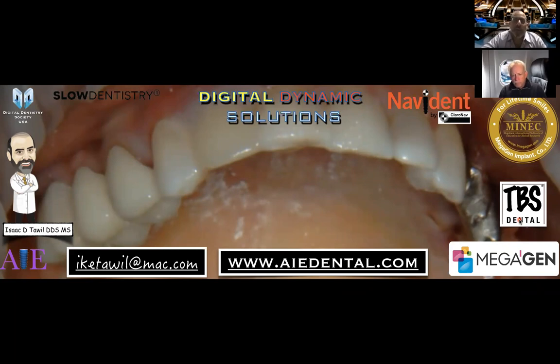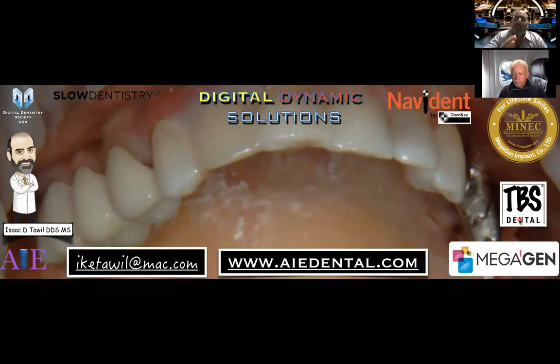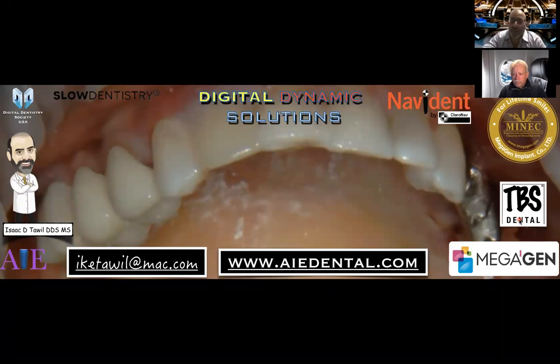Typically in the past, when I was trying to find these curved roots, I would make a guide, a 2mm pilot guide that would take me to that apex. But now with dynamic navigation, I can plan basically a miniature implant into that section where the curved root was, and know that I've actually hit that apex to the 1/10 of a millimeter. So having that curved root is no longer an obstacle for me. As a matter of fact, it may be a tremendous benefit.